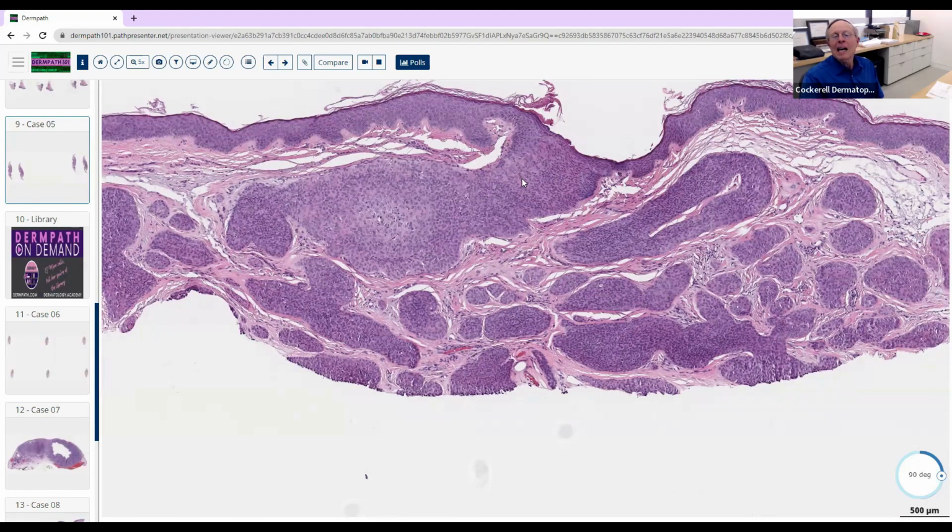So they're not going to ask you, if they show you one on the board, they won't show you this. They'll show you one that's purely in the dermis. But if you get into the poroid category, you've made an A. You're good. You're good that you've done that.